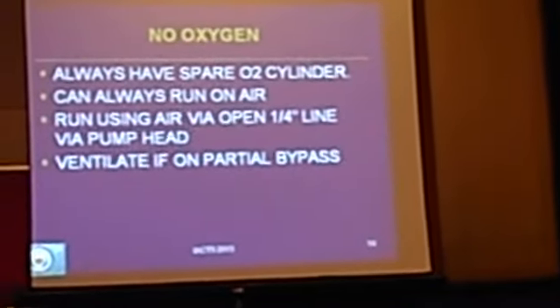Now we will talk of the next problem. Now there is a problem occurring here. He is on bypass. Reservoir volume is rising. Urine is becoming red.